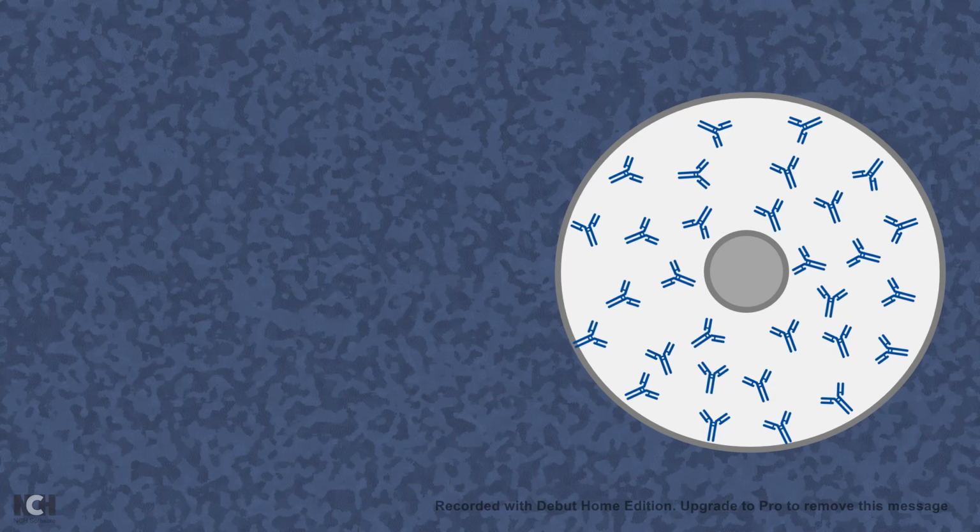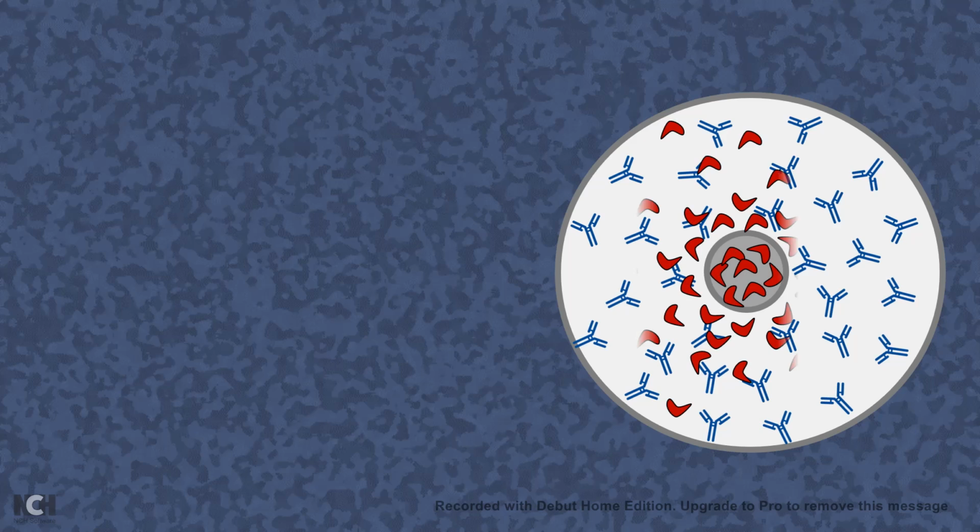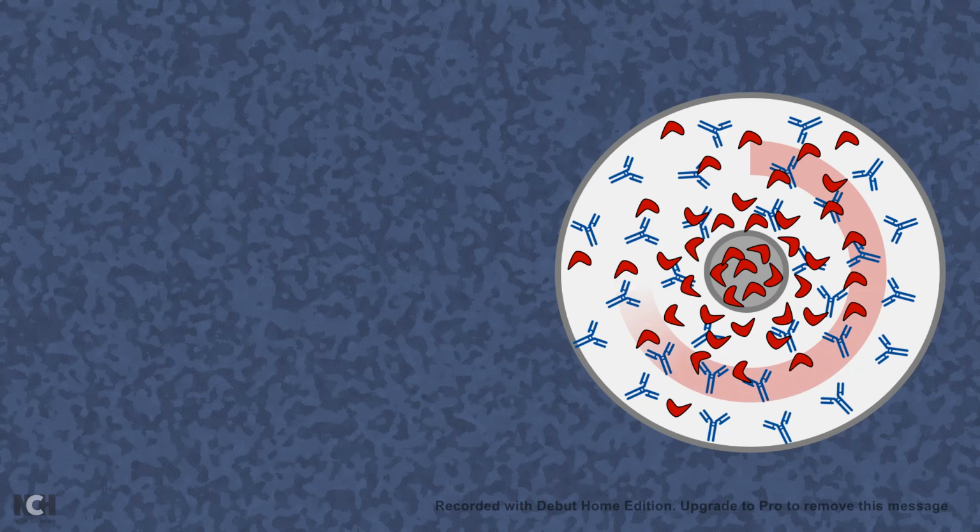Now, inside that, there is a well where we are going to put the patient derived sample, or our sample antigen which needs to be determined. Now, after putting it in, the antigen would start diffusing out from the well in all directions in a radial fashion, right? Now, let's look at the antigen and antibody interaction in a graphical format.